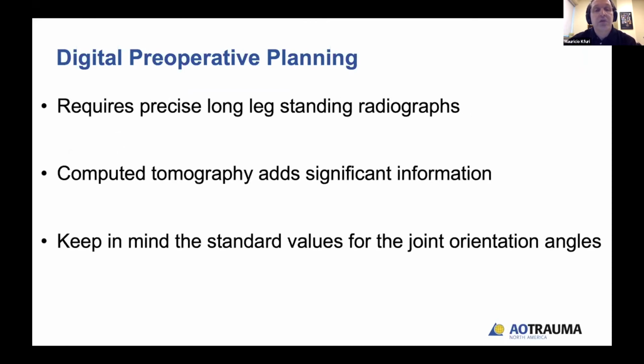The digital preoperative planning requires precise long leg standing radiographs. Computed tomography adds significant information, and keep in mind the standard values for the joint orientation angle.